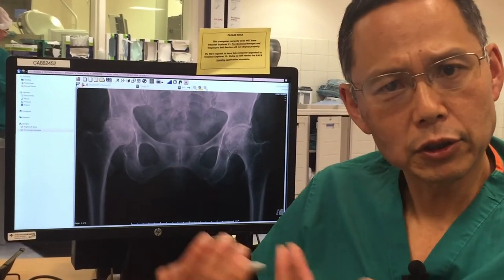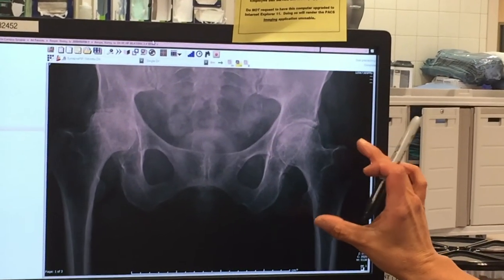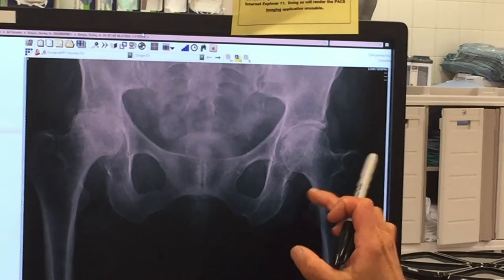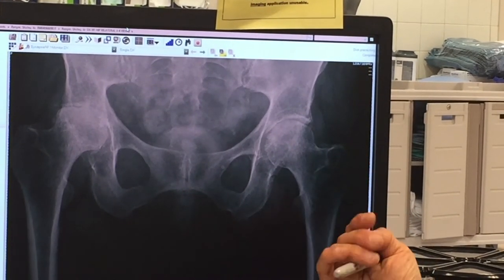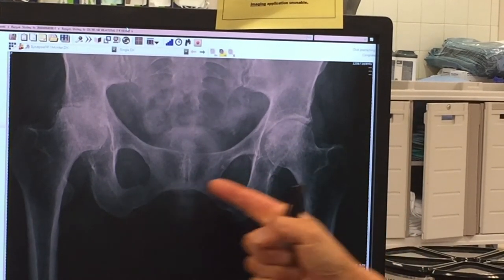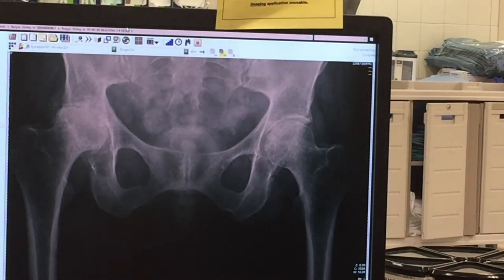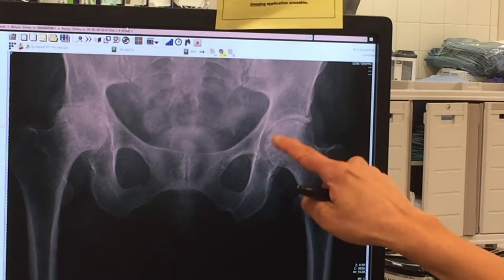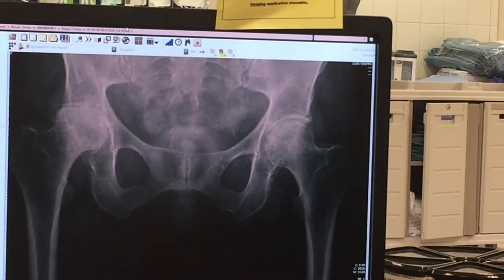I'll show you what we look at. Whenever we take an x-ray of the hip, we end up seeing both sides, and it's important because one side will serve as a control for the damaged side. So this is the bad side, this is the good side. A typical hip looks like this — there's a round ball and a round socket, and in between the bones there is a thick layer of cartilage.